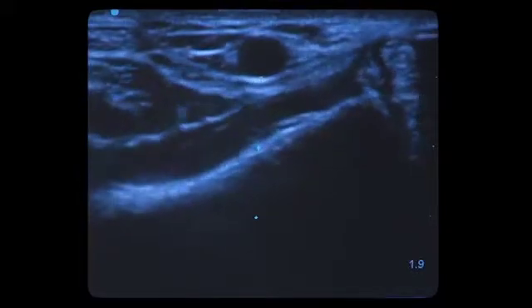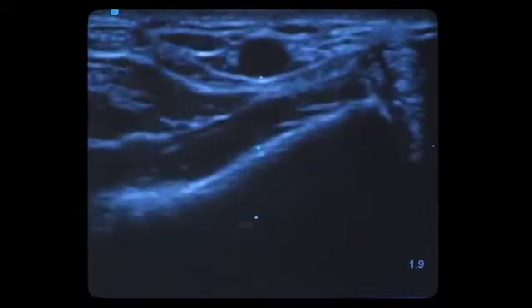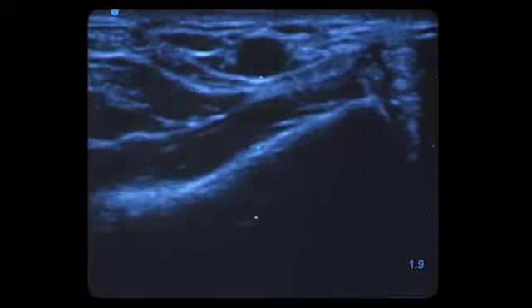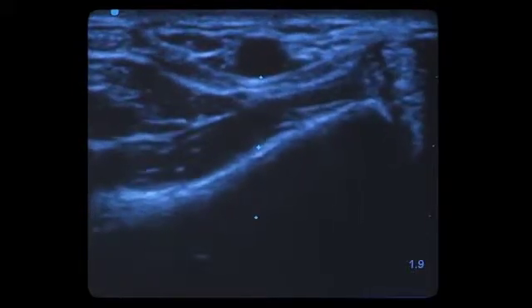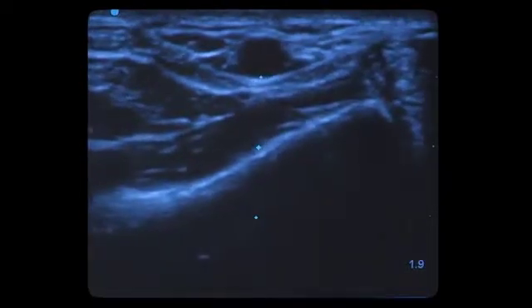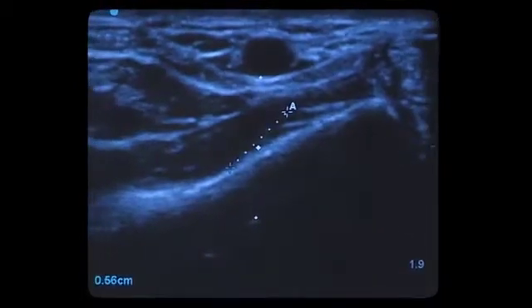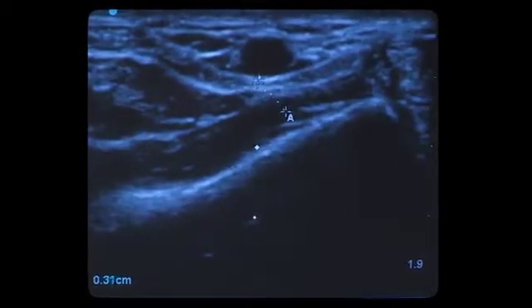The second thing we want to see is the diameter. I'm going to release and relax the ultrasound, just enough to see the artery. Exactly about one centimeter above the styloid process, I would like to see the anterior-posterior diameter of your radial artery. We should never measure side to side, because otherwise you can underestimate the diameter due to compression. Measuring AP gives you the correct diameter.